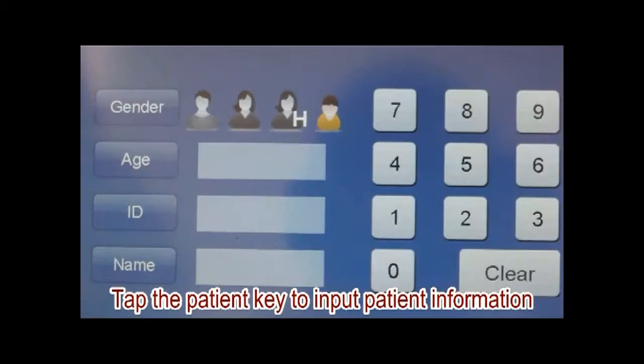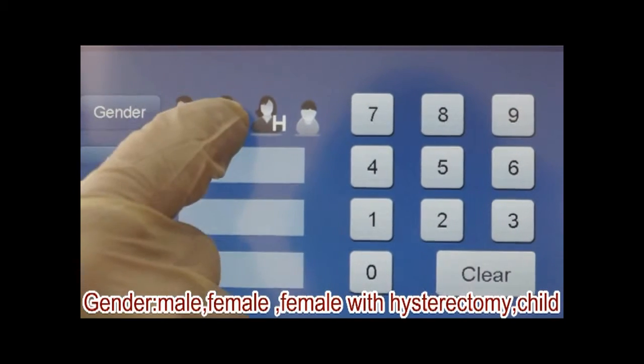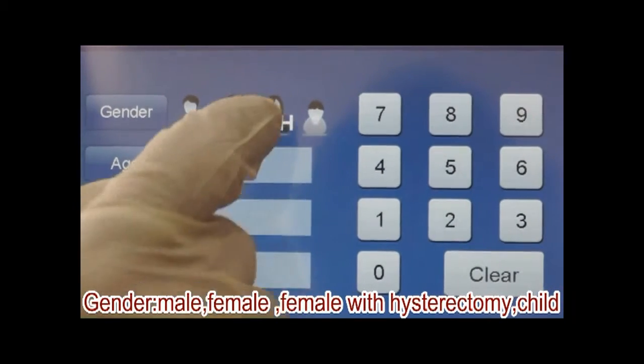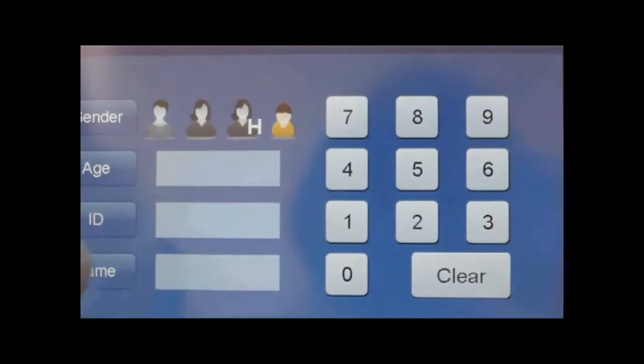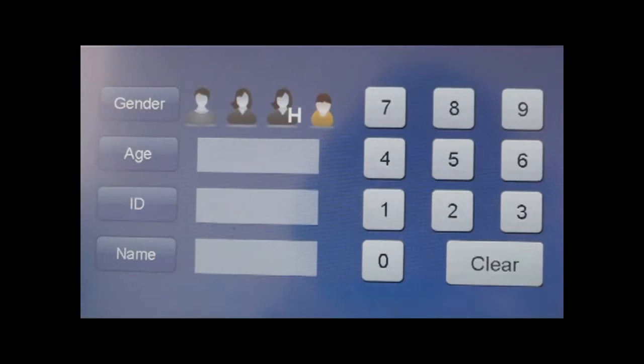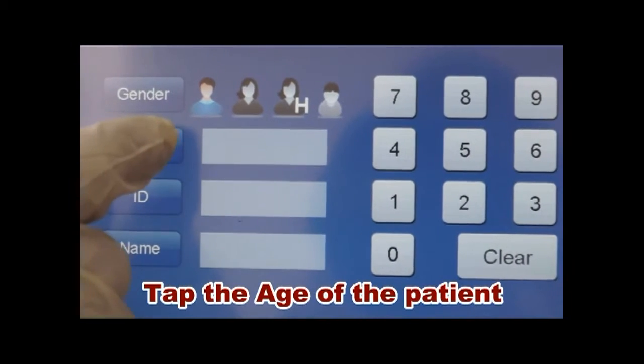Tap the patient key to input patient information: male, female, female with hysterectomy, or child. Tap the age of the patient.